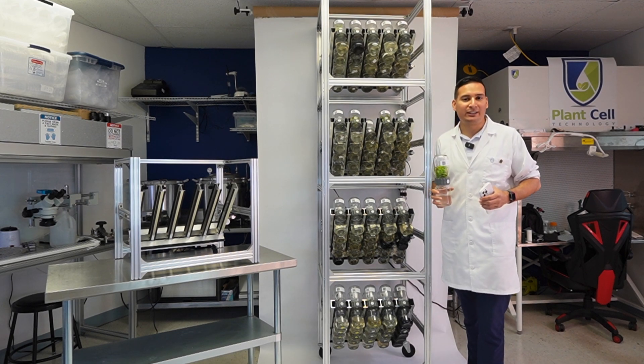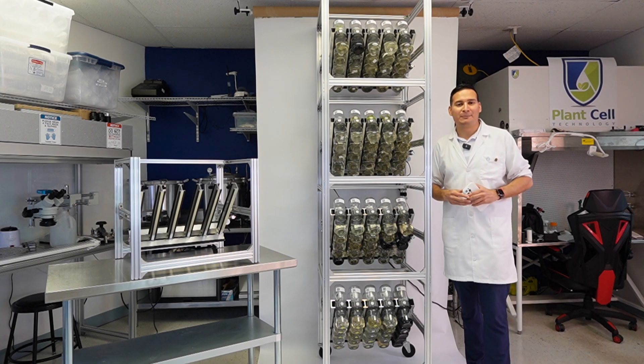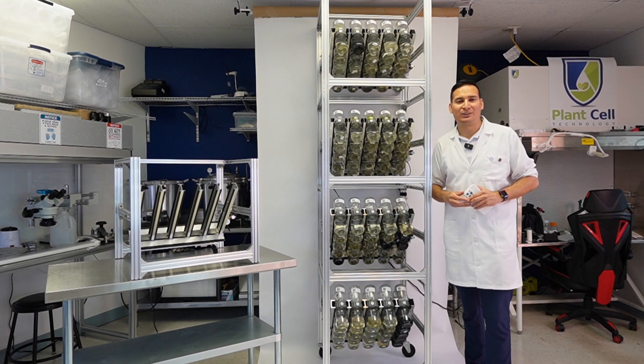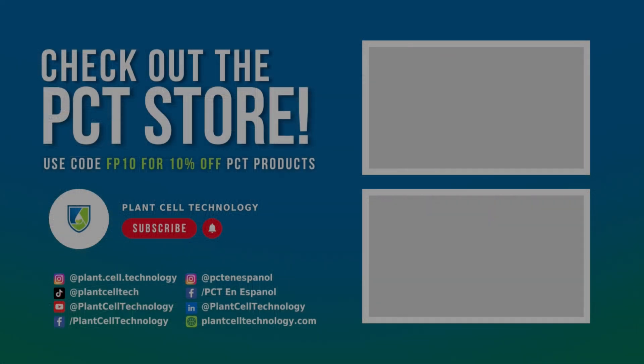That's just a fraction of the cost of this system. This is why the BioTill is the most affordable, efficient, and easiest way to grow plants in tissue culture. For more information about the BioTill, visit plantcelltechnology.com. Follow us on social media for more content, and use code FP10 for 10% off your first purchase.